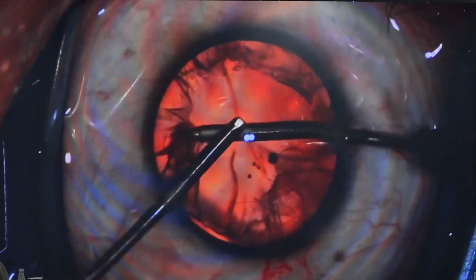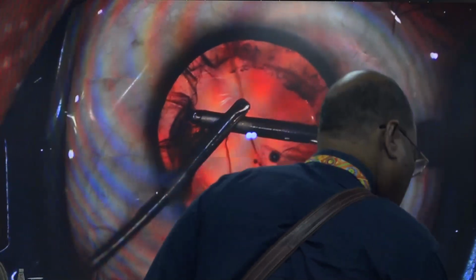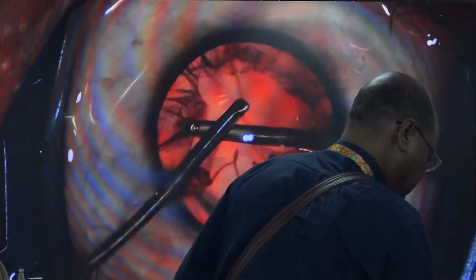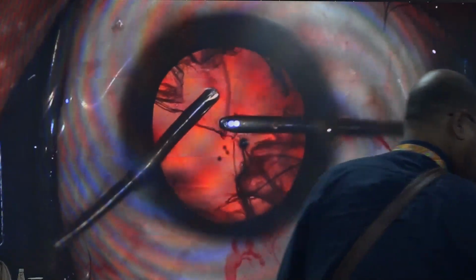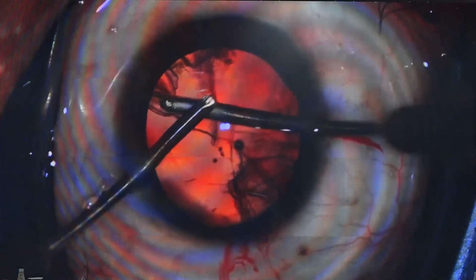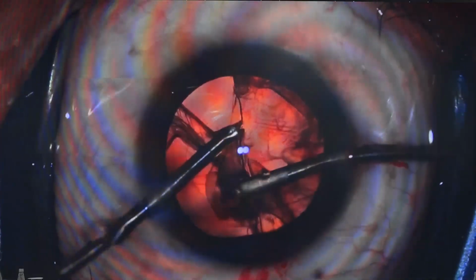Aspiration irrigation, I prefer the bimanual approach. This is my own devised Bhargav hydro implantation irrigator, which has a flow directed posteriorly, so it maintains the anterior chamber much better than the conventional irrigator which has a bidirectional flow.